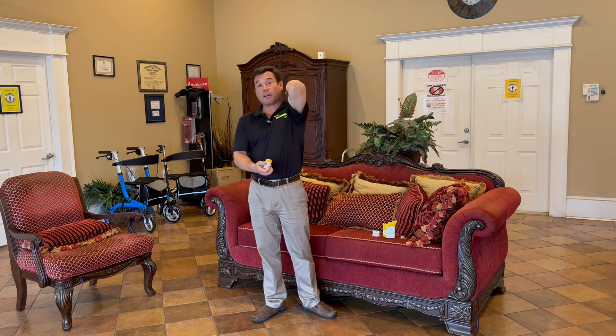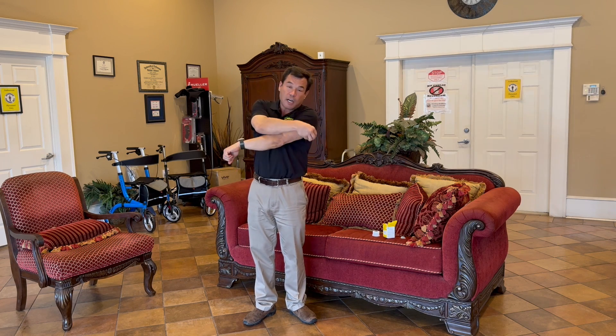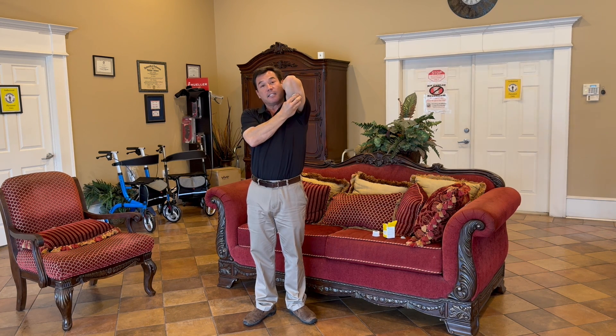We're going to take our arm, and again as I stated last time, we're going to lift it straight up. We're not going to try and go across our body. We're going to go right to the spot and put it on just like so. Hold it, let the adhesive adhere, pull it off — boom, you're good to go.